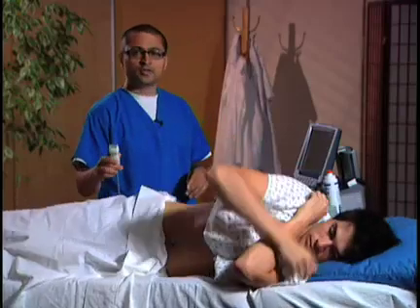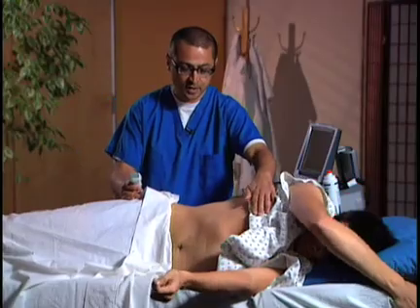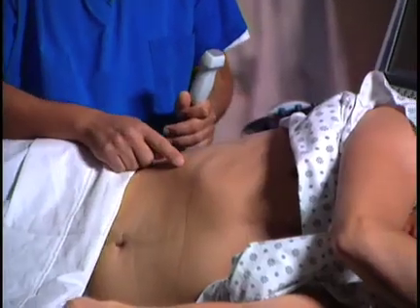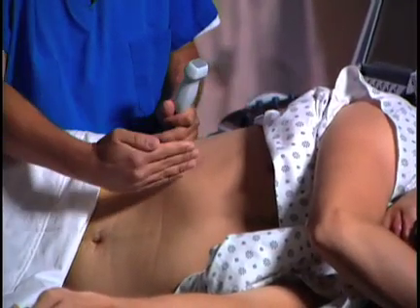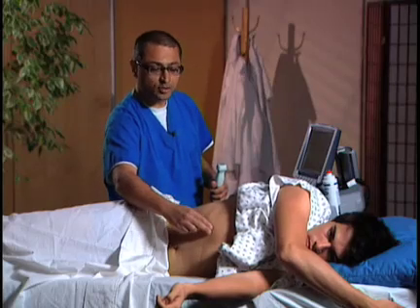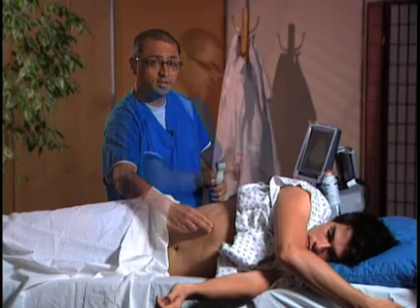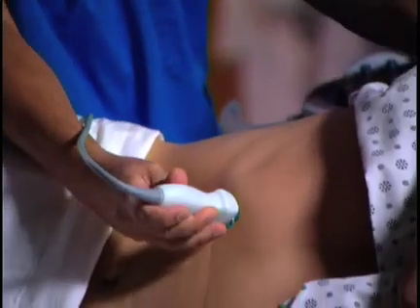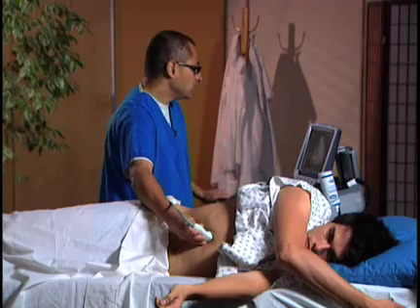I have the patient turn to the left lateral decubitus position, and I like to have their elbow up as well. Next, I draw an imaginary line along the costal margin and an imaginary perpendicular line along the line of the shoulder. I'm going to put my transducer right about in this area, and I should have a very nice long axis of the gallbladder. The transducer marker is right here — I'm at the costal margin, pointing toward the shoulder, and I'll try to find the gallbladder.